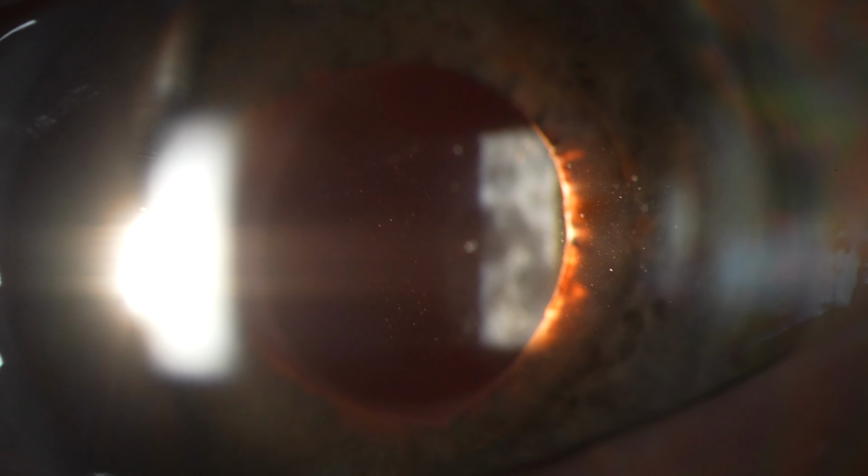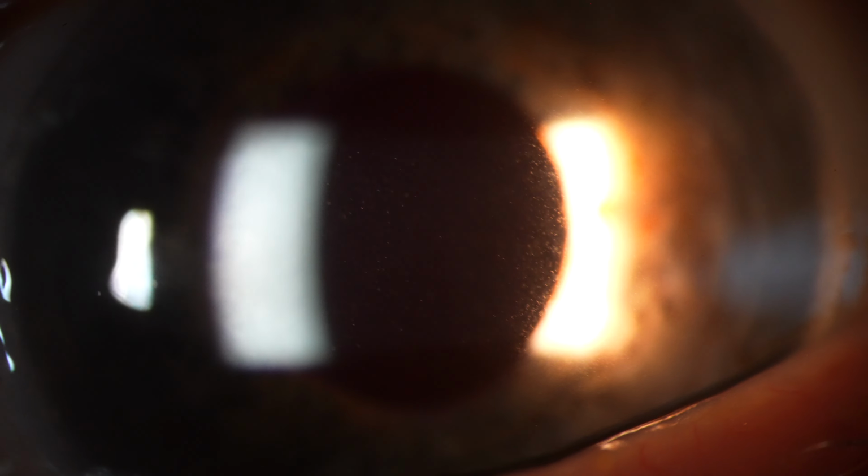So we can see there looks like there's some cells in the anterior chamber. But are they cells? They look a bit darker than cells from inflammation normally would, and maybe a bit pigmented. So are they from the iris? Is there some blood? Where is it coming from? Let's carry on with the exam.